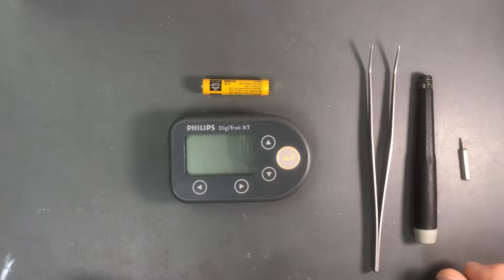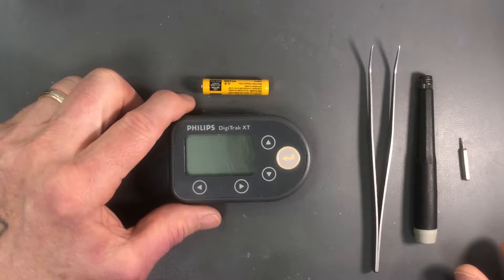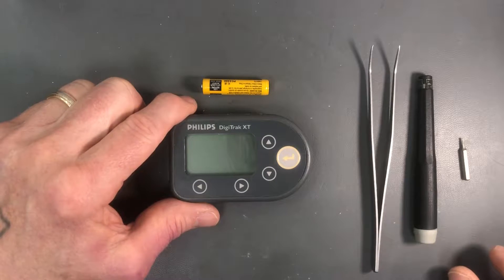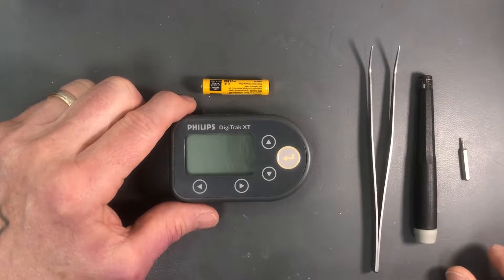This video demonstrates how to perform the field remediation for the Philips Digitrack XT Holter monitors that are exhibiting the error 602 problem, which occurs when you insert a battery into the device after the January 1st 2020 date.